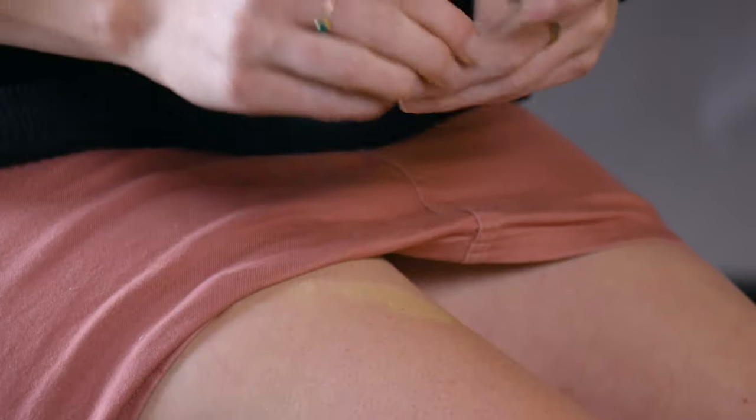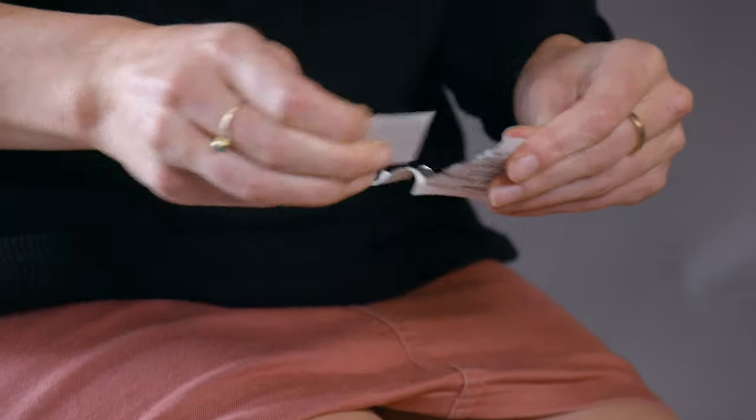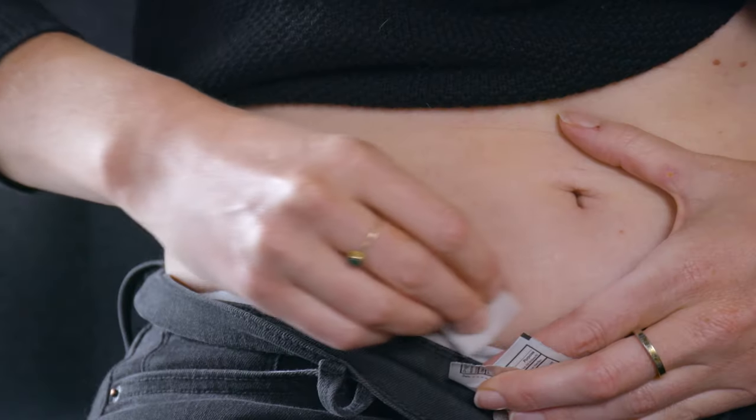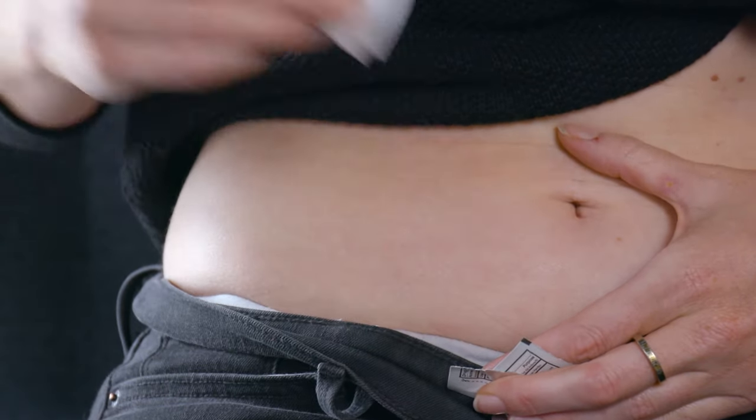Once you have chosen the area that you will be giving yourself the injection, use the alcohol pad to clean the area and allow the area to dry. Do not blow on it.